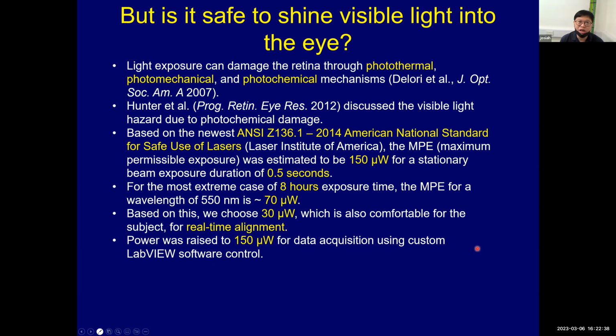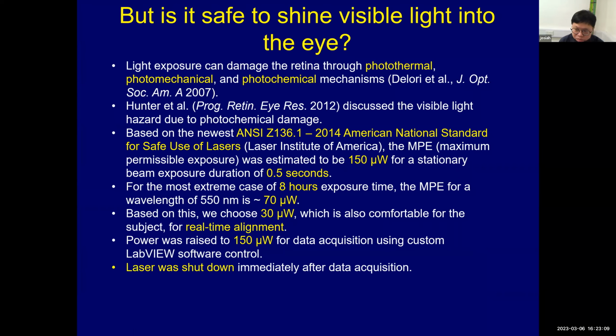For reference, the power people send for NIR can go up to 1 milliwatt or 800 microwatt, so it's substantially different. It is challenging to measure such low power, and you have to make sure that when you measure 150, it's really 150 and not 180. These are considerations you always have to be careful about with visible light.